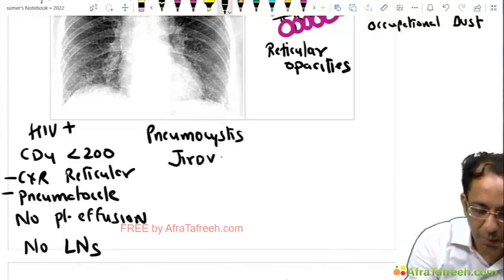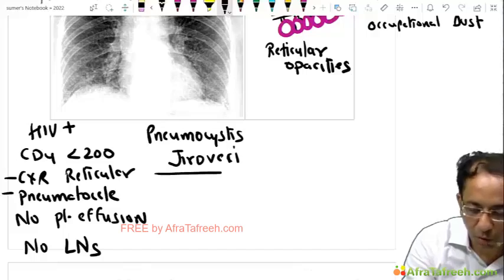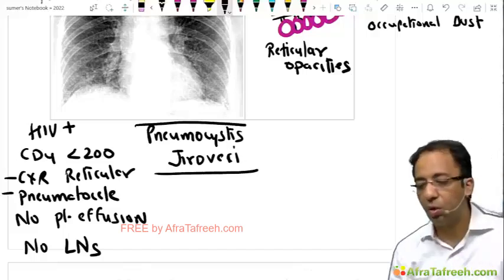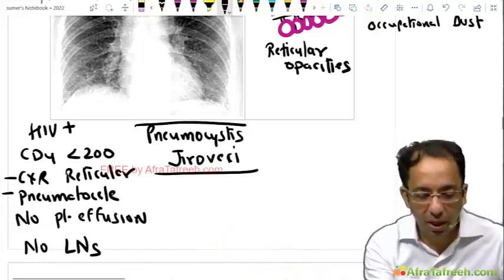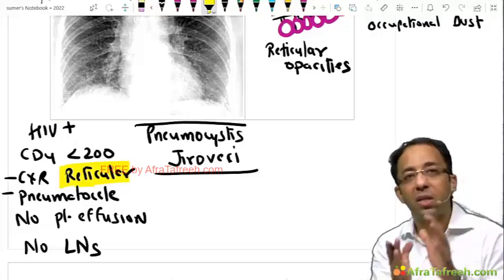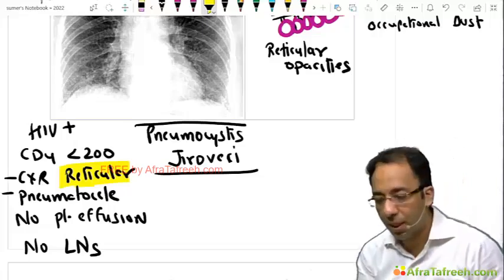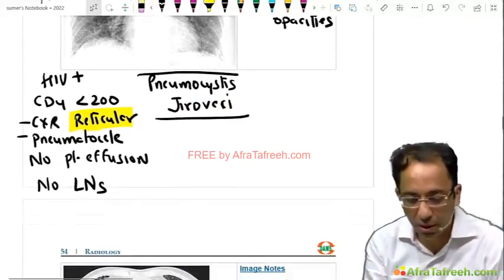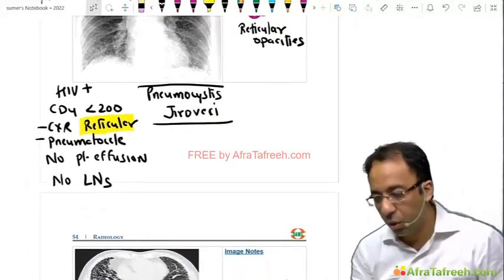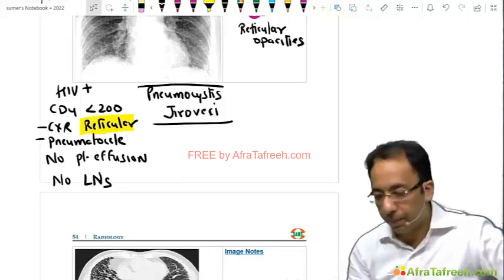Okay, the PCP you were asking about, now you understand? Pneumocystis jirovecii pneumonia. So this is how they create a question, but the key word here in radiology is reticular, interstitial problem. Clear? I will give you one more question. This is for distinction now. Let's see how many of you can answer. And the drug that you will use will be cotrimoxazole.